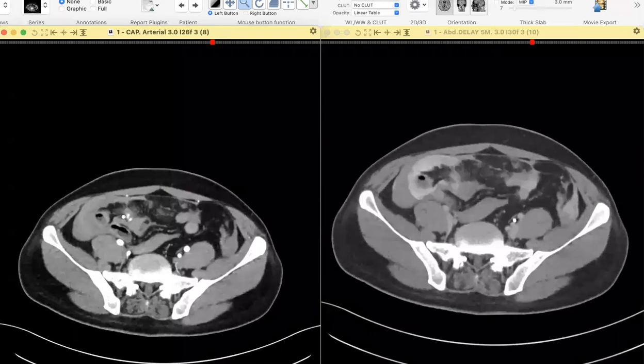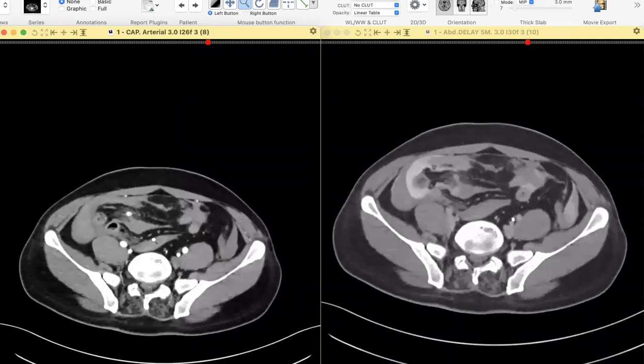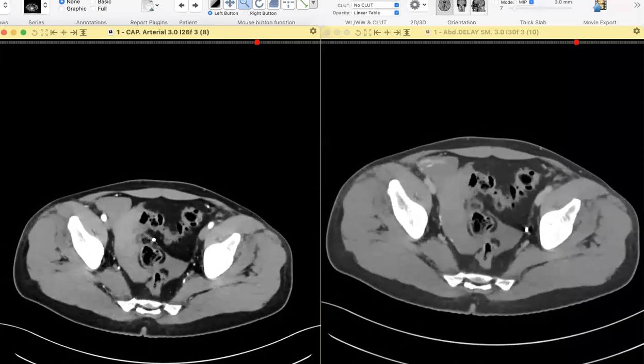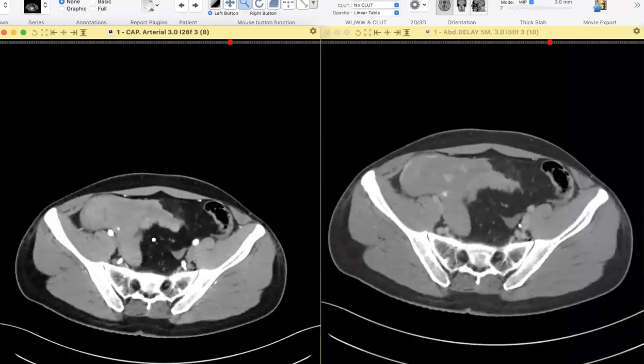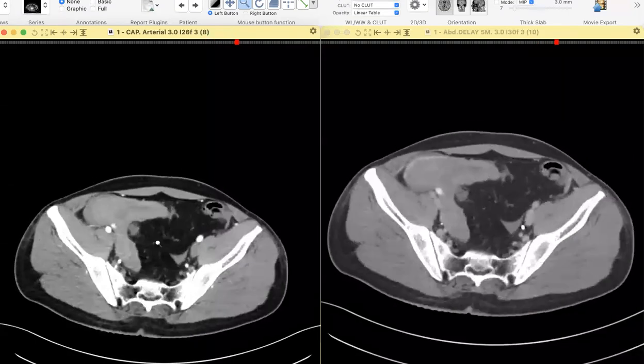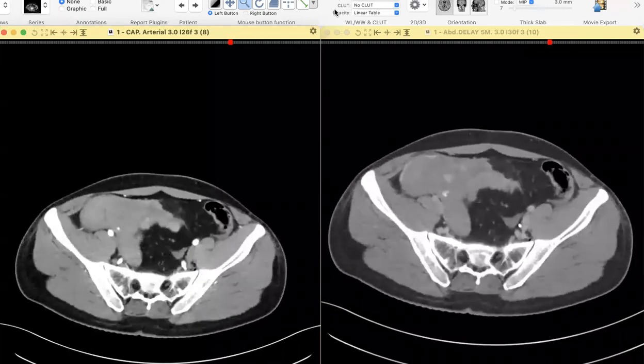Basically, this is a mesenteric tear. Why would you have hemorrhage from an external iliac artery? What would penetrate it? What would cause it to disrupt? So for branches of the superior mesenteric artery, if you have a mesenteric tear, that can lead to hemorrhage. Yeah. Okay. Okay. Thank you.